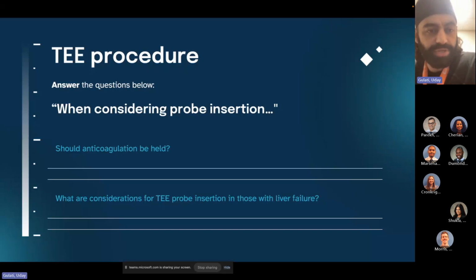So now, what about the patient that, obviously if the patient has a stricture, you don't want to put the probe in, right? If they've got that diverticulum or that Zenker's diverticulum, you don't want to put that probe in there, right? Because it can cause a lot of mechanical complications that are pretty severe.